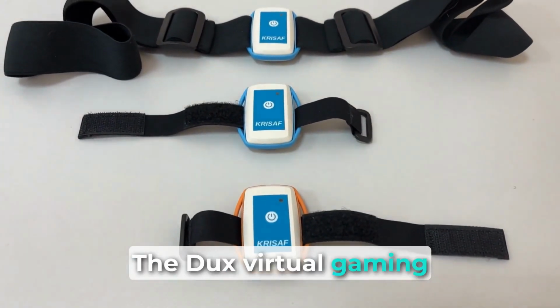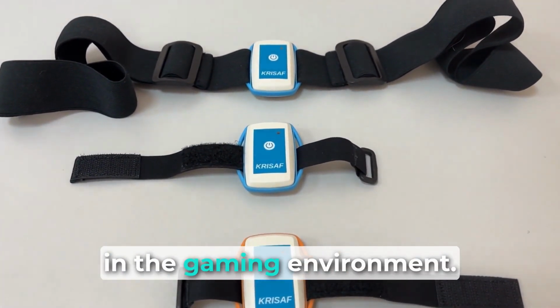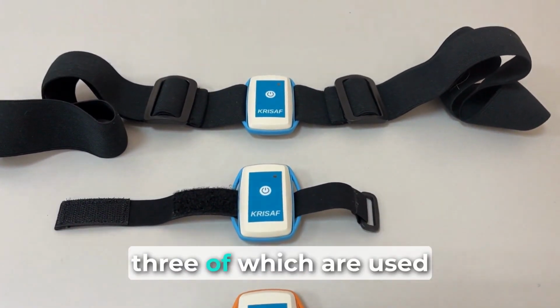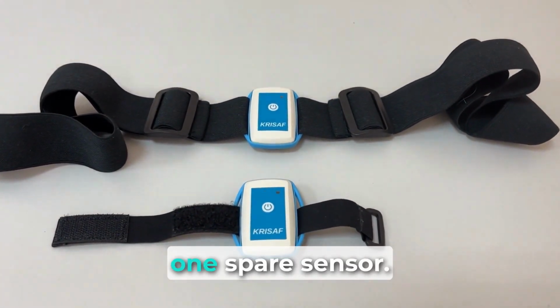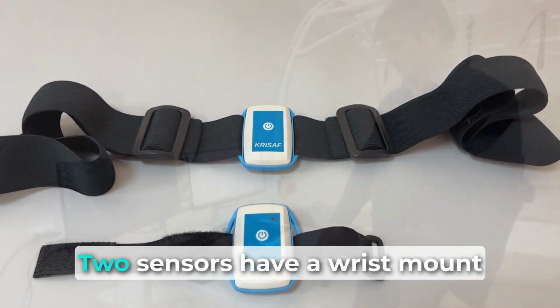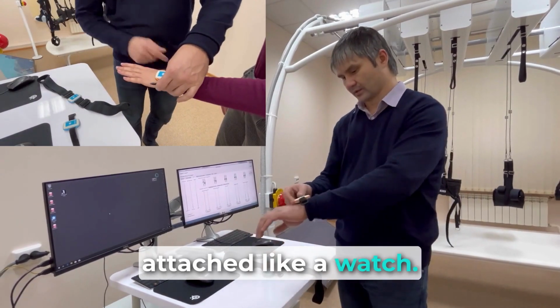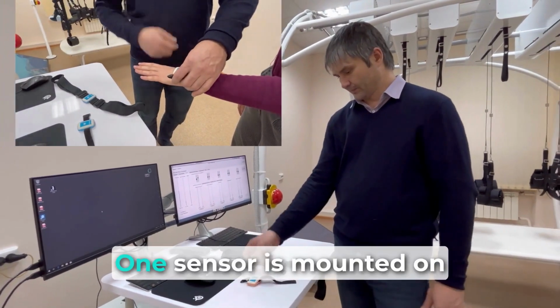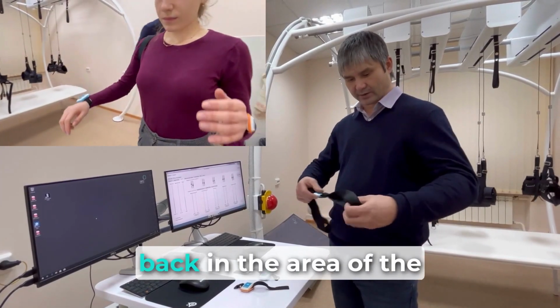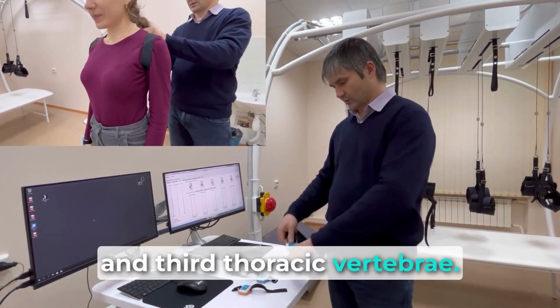The DUS virtual gaming environment control sensor is used to control the character in the gaming environment. The complex comes with 4 sensors, 3 of which are used simultaneously and 1 is a spare. 2 sensors have a wrist mount in the form of a strap, attached like a watch. 1 sensor is mounted on the patient's body. The sensor is located on the back in the area of the spinous processes of the second and third thoracic vertebrae.